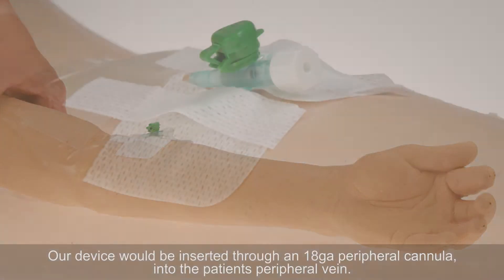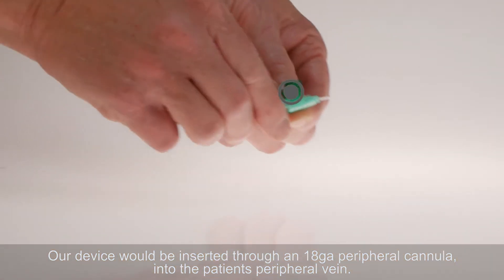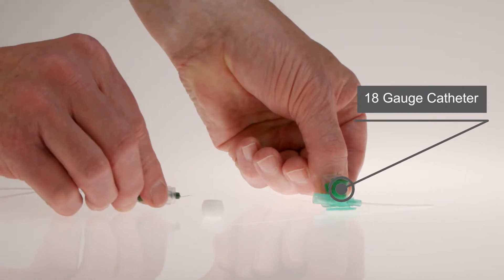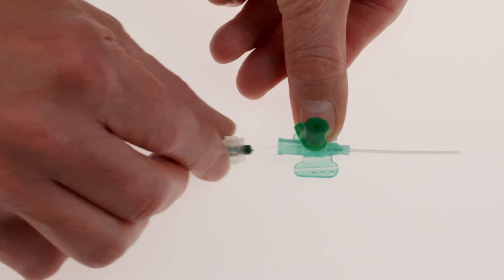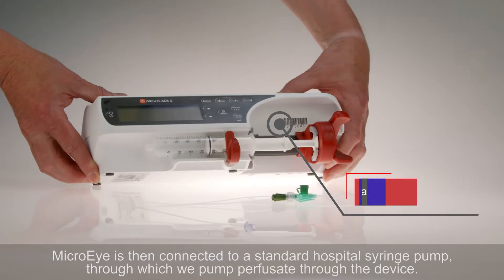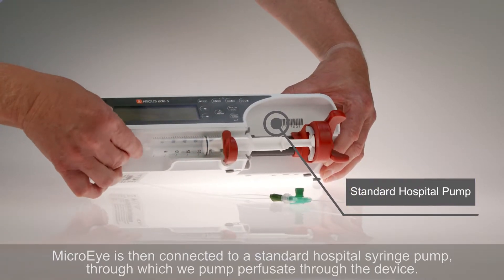Our device would be inserted through an 18-gauge peripheral cannula into the patient's peripheral vein. MicroEye is then connected to a standard hospital syringe pump, through which we pump perfusate through the device.